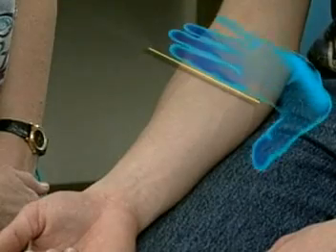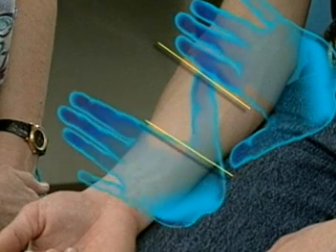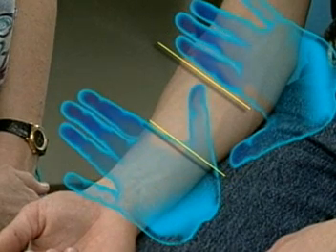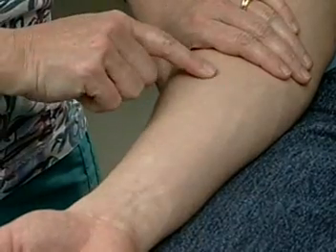Landmarks for the forearm are 3 to 4 finger widths below the antecubital space and 1 hand width above the wrist. Identify the antecubital space and the wrist. Choose the site.